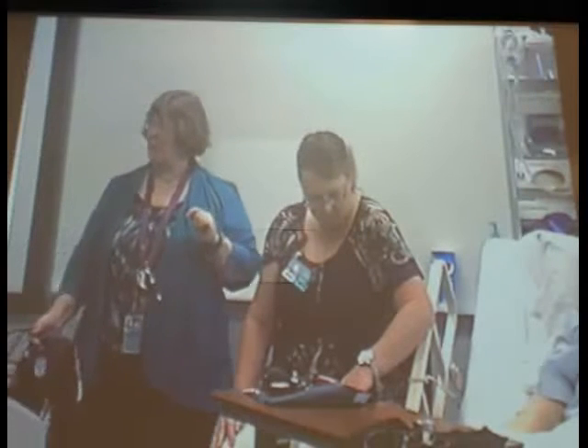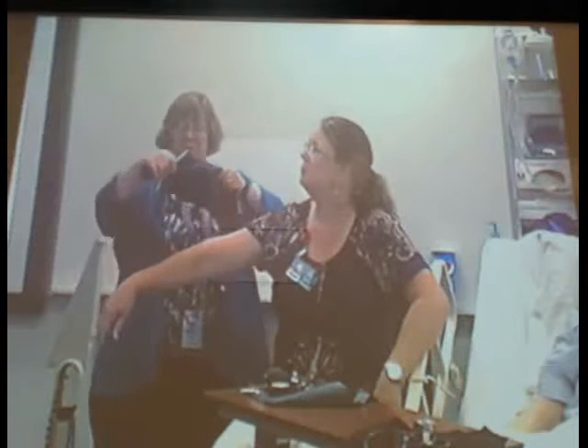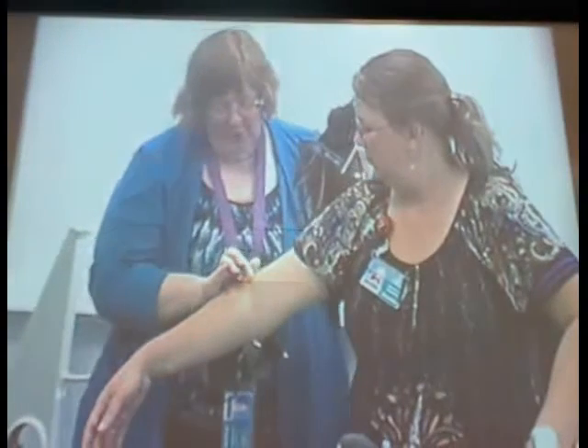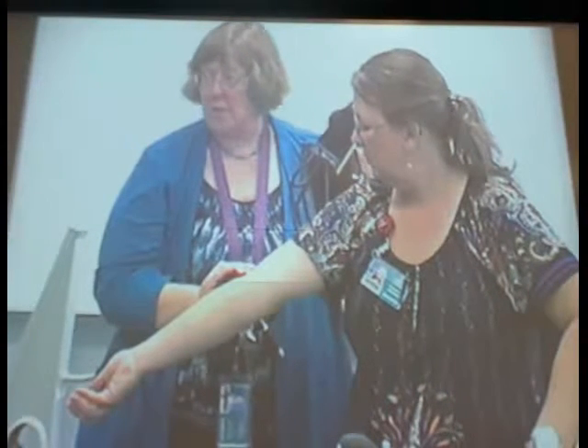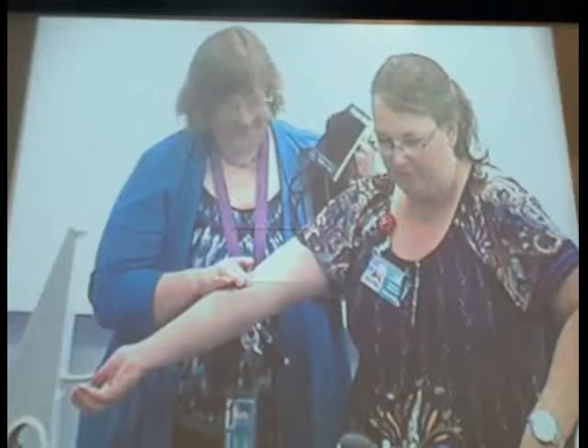That would also count for males — males can have mastectomies and breast cancer. The concern with mastectomy is lymph node involvement and the lymphatic system. Breast augmentation should not affect blood pressure because we're not disrupting the lymph nodes. Now I'm using her right arm, and the cuff tells me where to find the artery so I can place the arrow there.